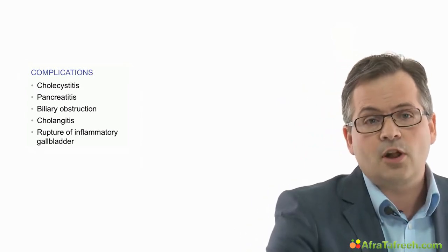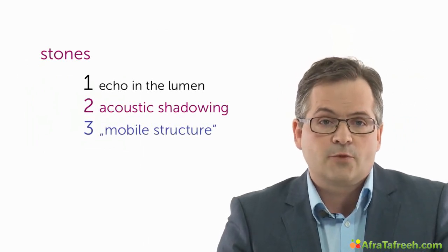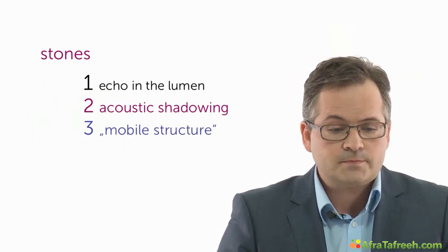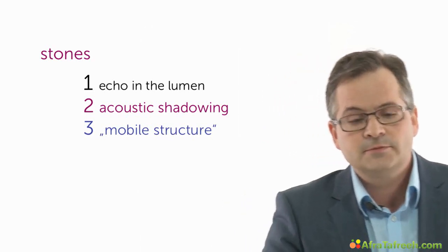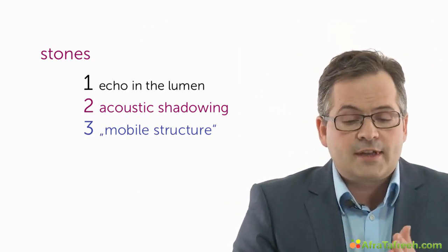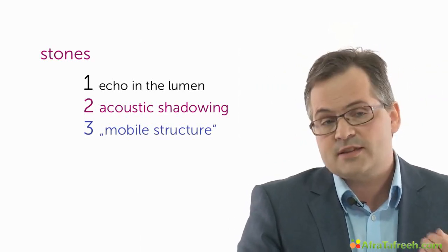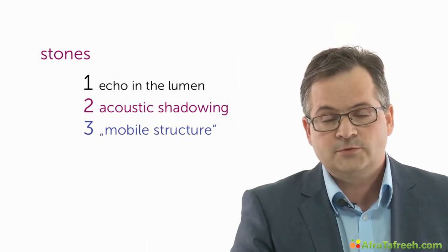So, stones in the gallbladder will reflect the sonic waves, and that's the finding we are looking for. If the stone contains lime, no sonic waves will pass through it. Therefore, an acoustic shadowing will appear behind the stone, a black stripe on our screen.